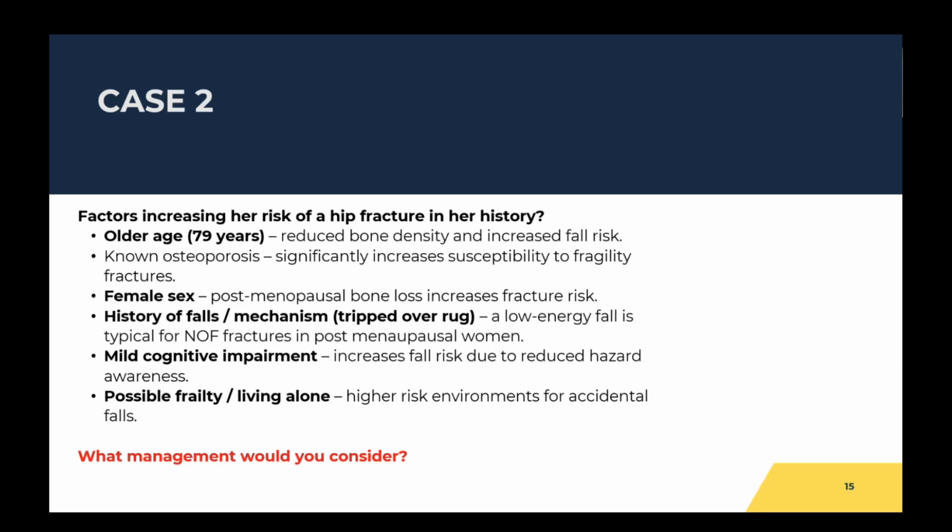Can you be more specific? So how would you manage this patient if you saw her? Hemiarthroplasty, hip replacement, surgical intervention? Yeah. Okay, so let's look at the answers.